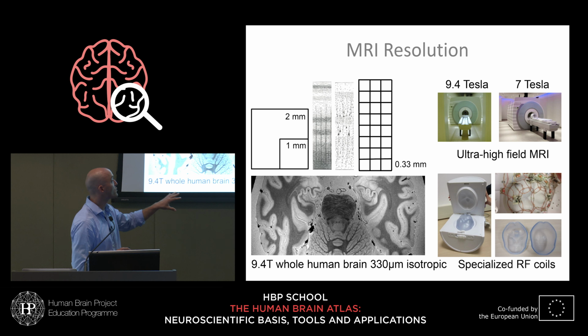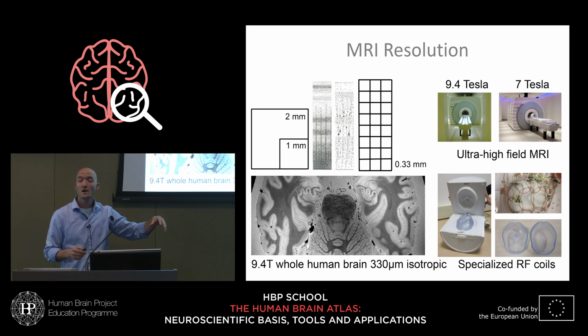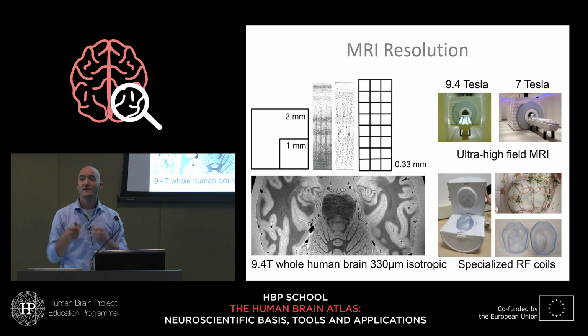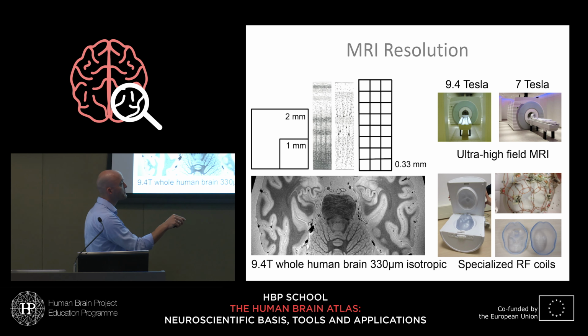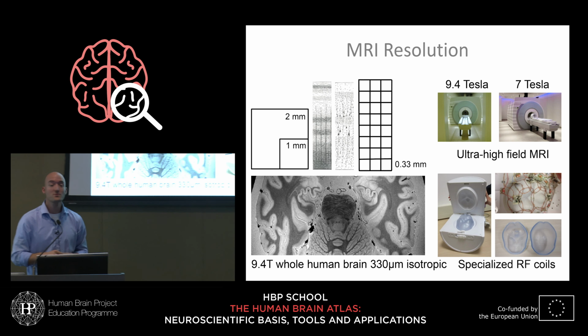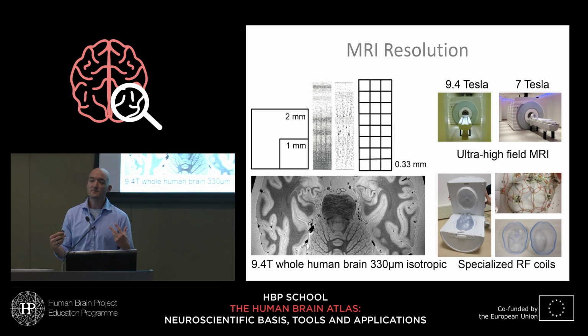Right? So if you're serious about whole human brain imaging post-mortem, you don't use a human in vivo coil that has a hole at the neck. It has to, because our heads are still attached to our bodies, very trivially, but that's where there are no coils, and they have to be further away from the brain because there's our skull, right? And there have to be some cushioning and some measure for having different brain sizes. We got a lot more signal by building this specialized container that exactly can contain human brain samples, get all loops very close to it, and get much more signal from it.